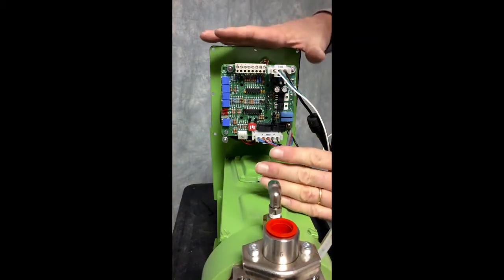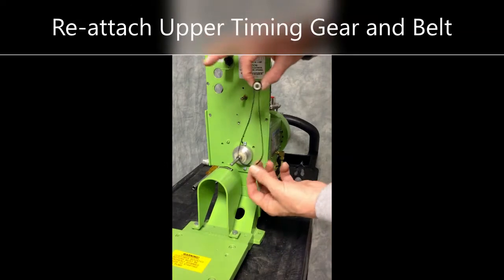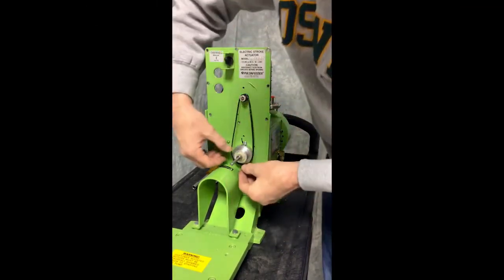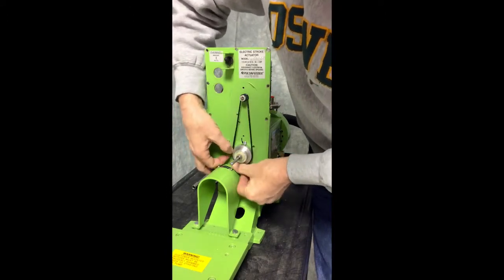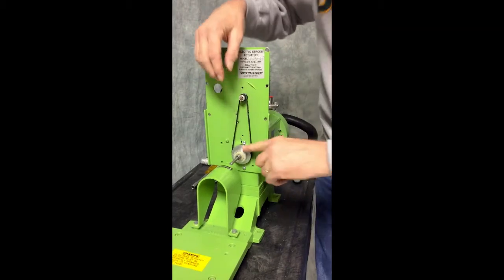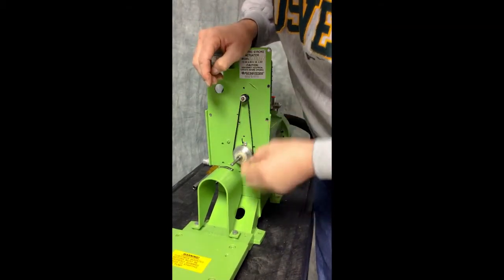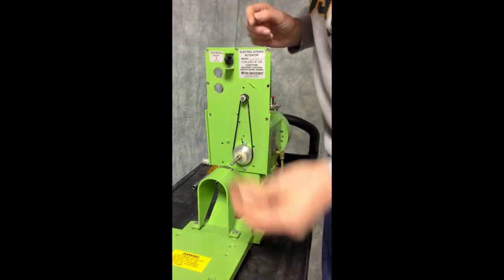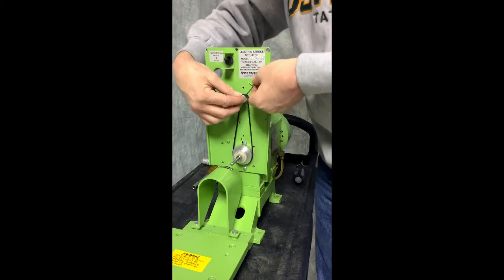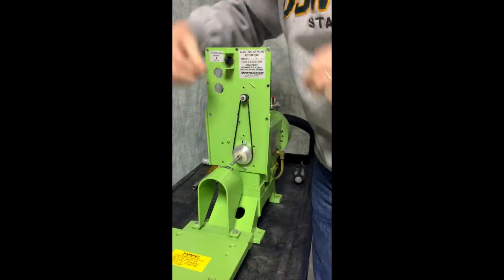That would complete the front half of this rebuild. The next step is to replace the timing gear and belt. We are going to slide the belt on and align it, making sure that the alignment markings that we made earlier are still in the right place. We will take our Allen head and re-tighten and lock that on.